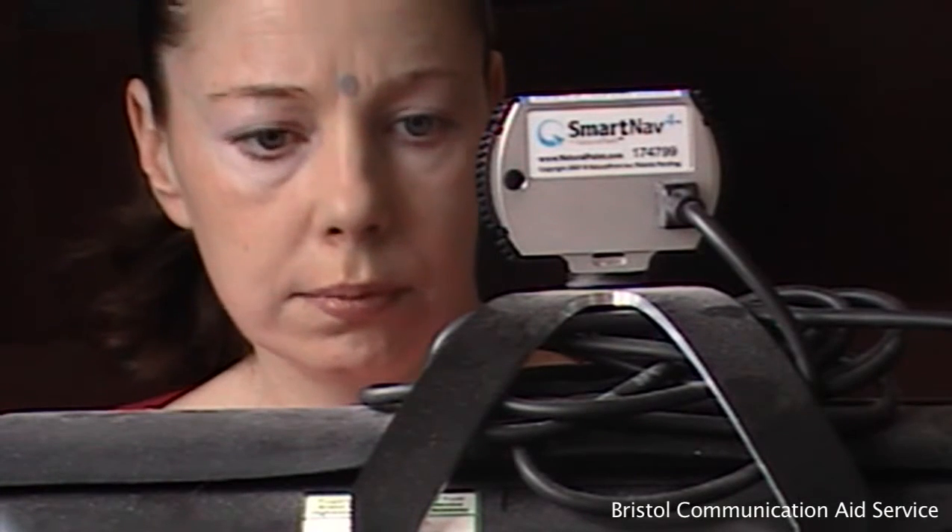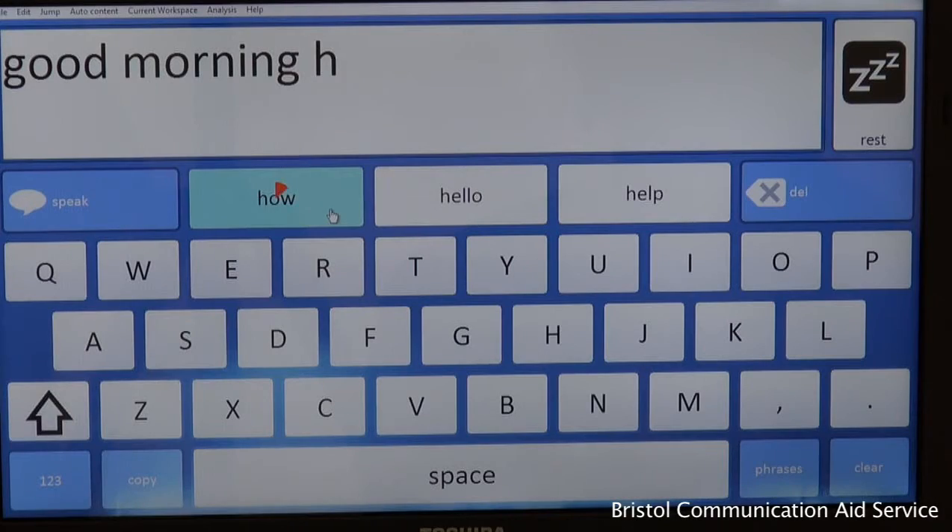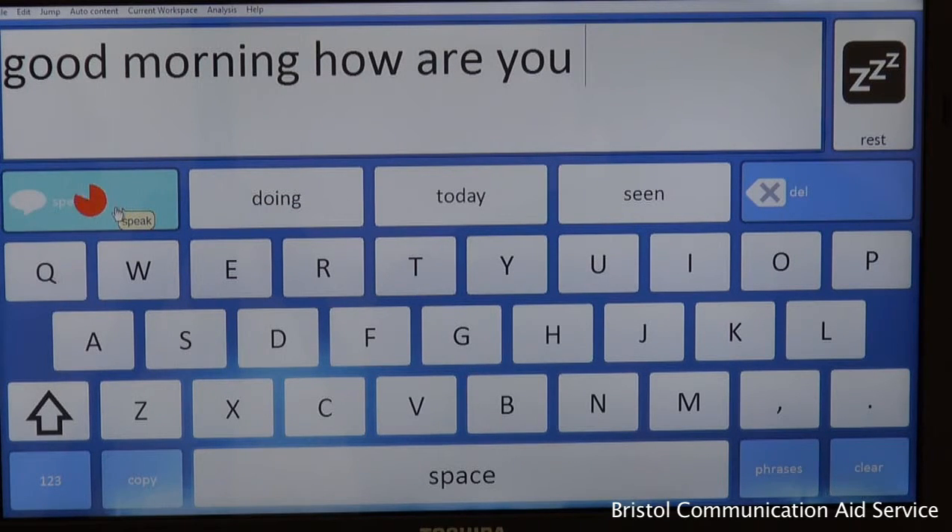To operate your communication program, move your head accordingly so that the cursor is resting on the option you wish to select. By holding position and allowing the dwell timer to finish, your option will be selected, enabling hands-free communication. For example: "Good morning, how are you."